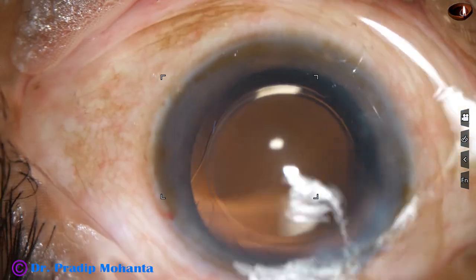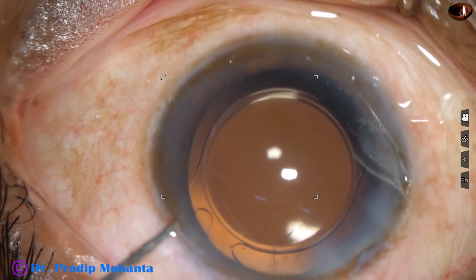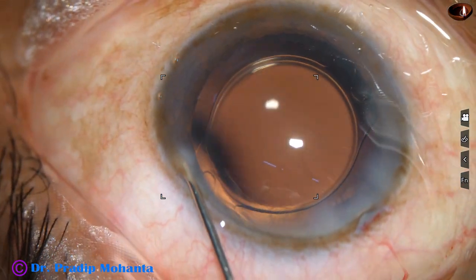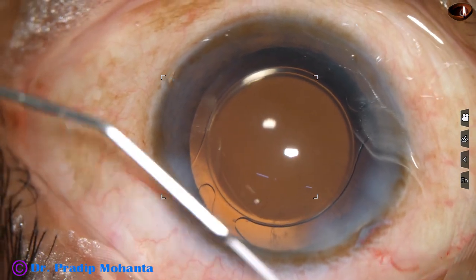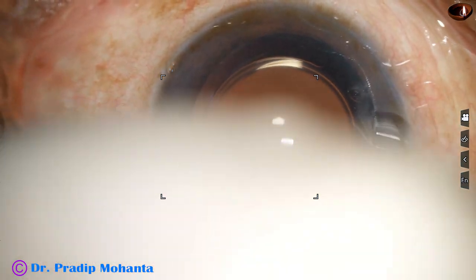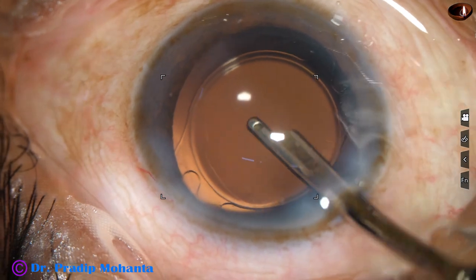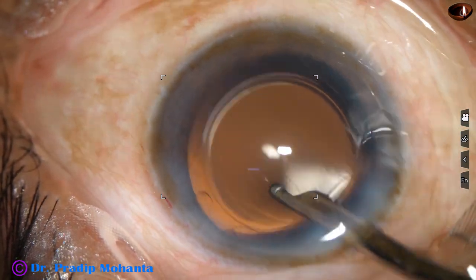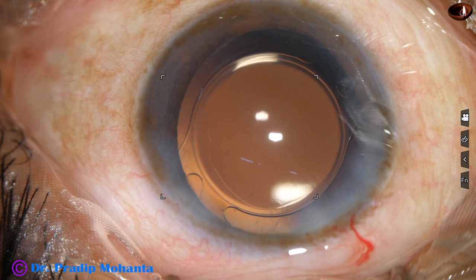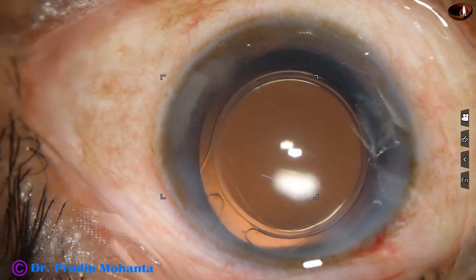A little bit of polishing of the posterior capsule is done, and we have almost completed the case in about 6 minutes. The side port is closed by hydrating the corneal stroma, and then a final lavage of the anterior chamber is done. Any visco that sticks to the corneal endothelium is removed by flushing a gentle stream of BSS towards the corneal endothelium through the aspirating port. Integrity of all the wounds is checked and the case is concluded.